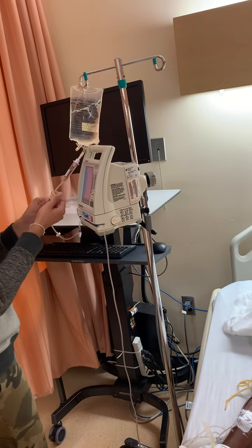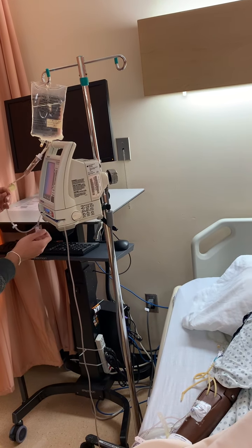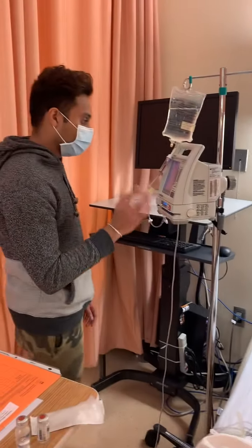And we see that the tubing has also been labeled, and it's not expired, so that's good. And we see that with the tubing, there are no air bubbles or kinks or anything, everything's open, all is running well. And we see the pump is at the right rate at 25 mL an hour, so that's good.